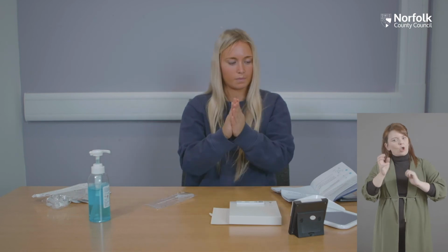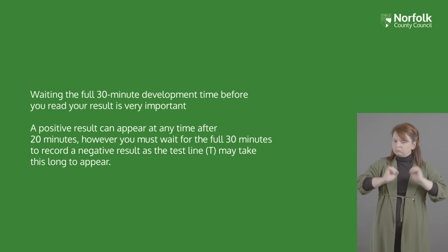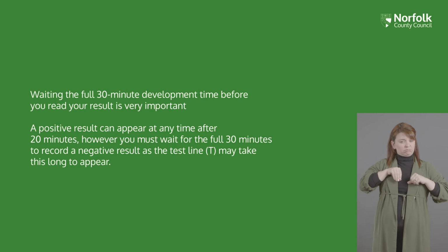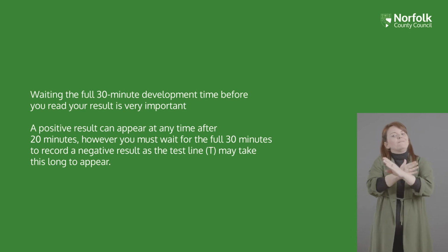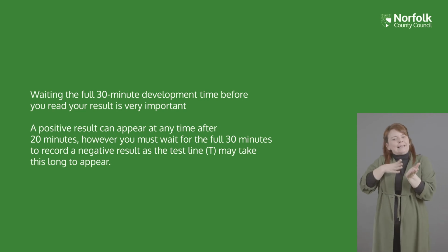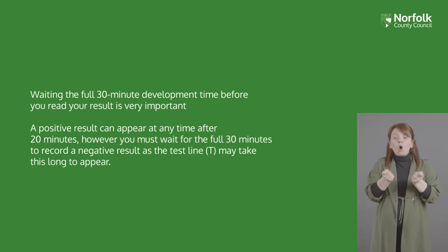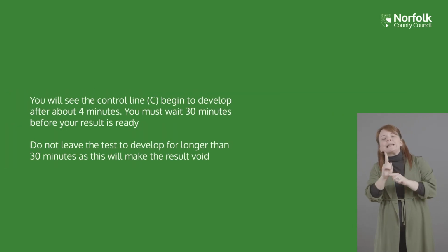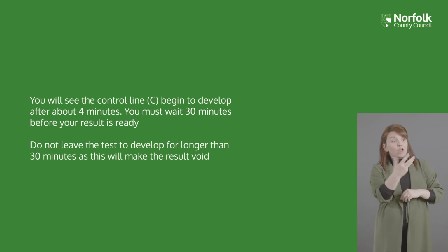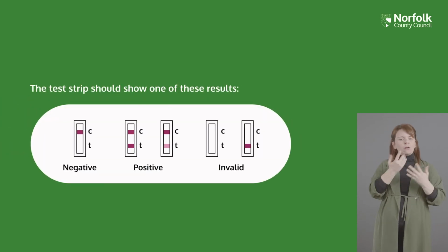Waiting the full 30-minute development time before you read your result is very important. A positive result can appear at any time after 20 minutes. However, you must wait for the full 30 minutes to record a negative result, as the test line, T, may take this long to appear. You will see the control line, C, begin to develop after about 4 minutes. You must wait 30 minutes before your result is ready. Do not leave the test to develop for longer than 30 minutes, as this will make the result void. The test strip should show one of these results.